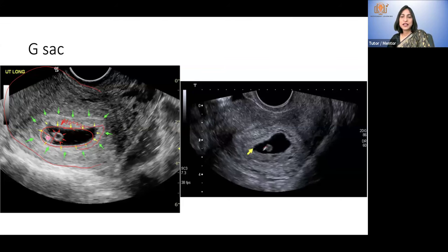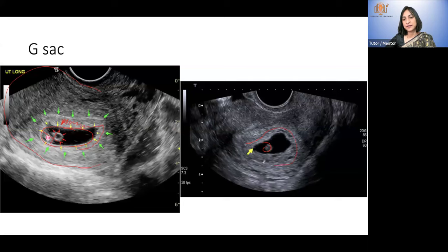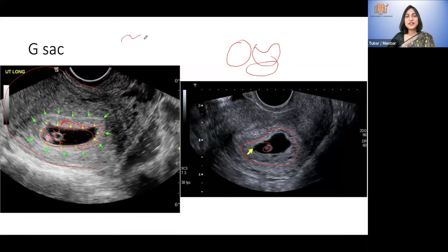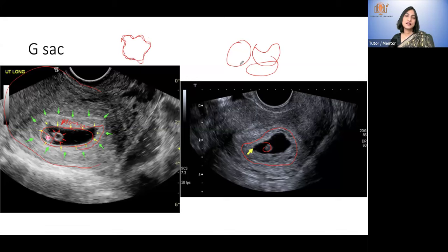Here you can also see a yolk sac. What I wanted to show is this white line of decidual reaction around the gestational sac. The gestational sac is generally circular, can be oblong, or even a little crescent-shaped — that does not matter. But if it is very irregular and the decidual reaction is very poor or broken at places, then it is a pregnancy of unknown viability or suspicious of missed abortion. These images all look like viable pregnancies.